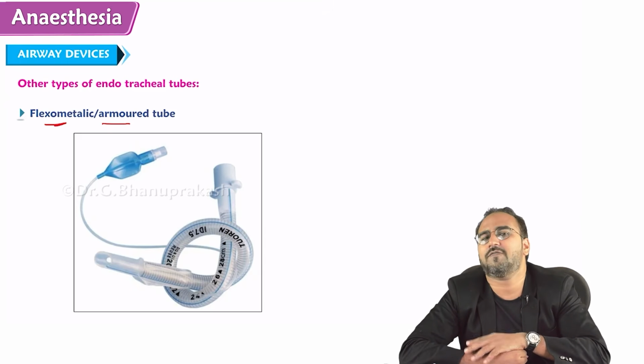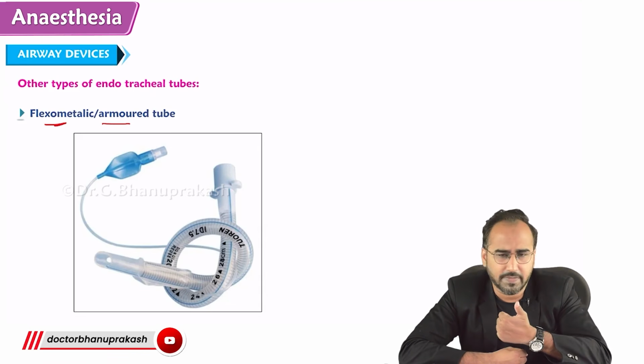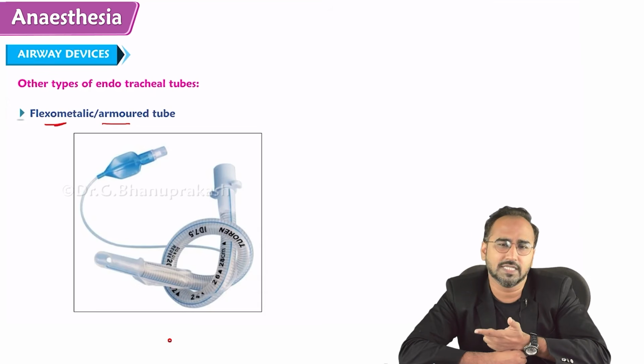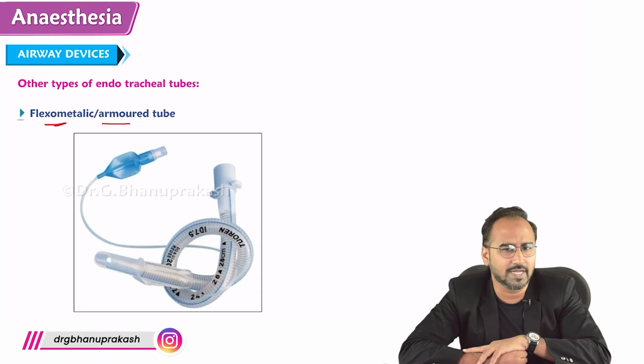In the induction phase, what should be my aim, guys? The first aim should be what? I should make the patient unconscious. The second aim should be what? I should make the muscles relax. The third aim should be what? I should intubate and ventilate the patient.